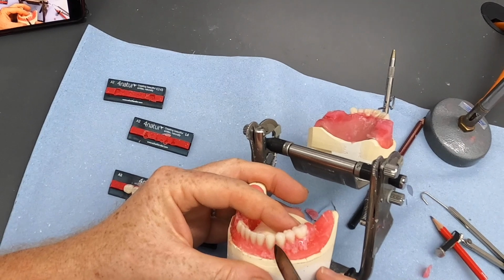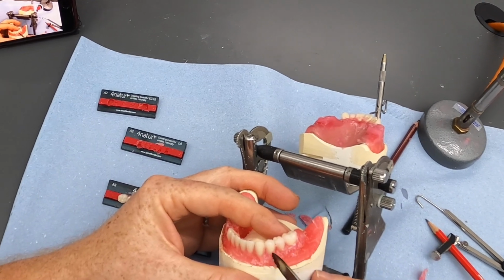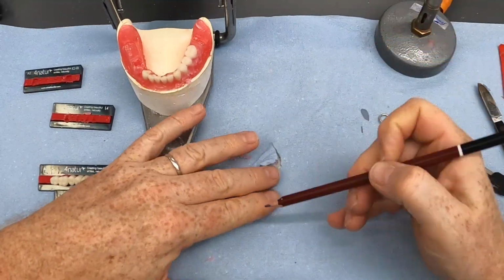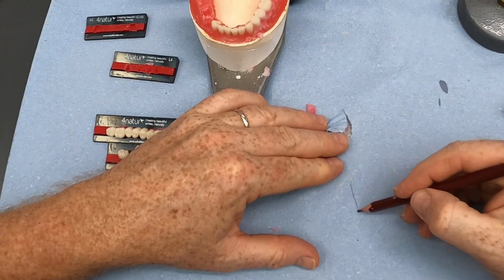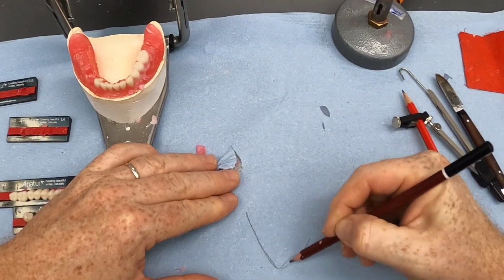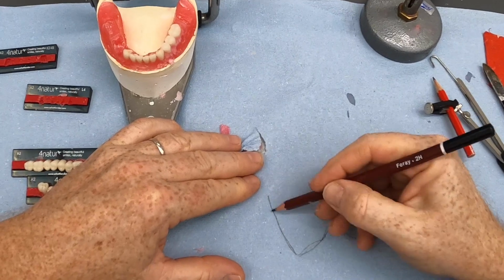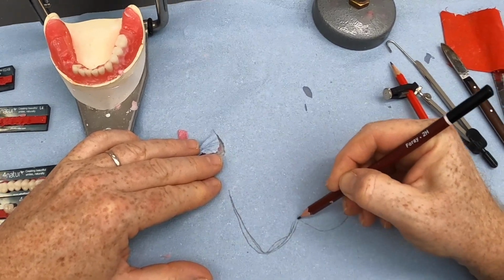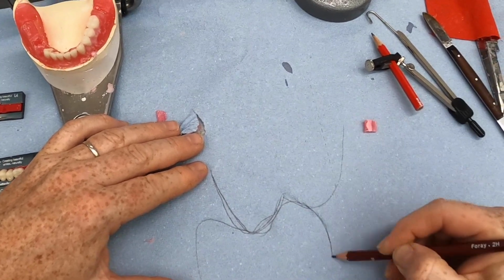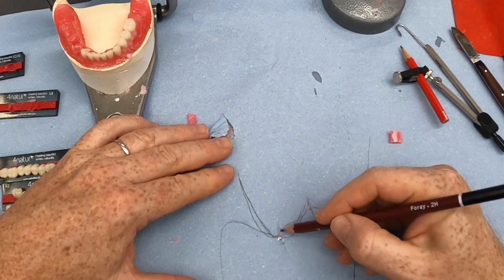Now at this point it's worth having a brief think about balanced occlusion, what we're trying to achieve and what the alternatives are. So remember, when we're thinking about balanced occlusion, if this is the upper tooth and this is the lower tooth, we're aiming to get contacts here and here between the teeth.